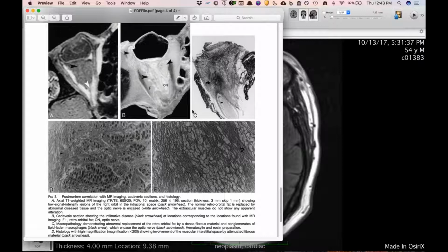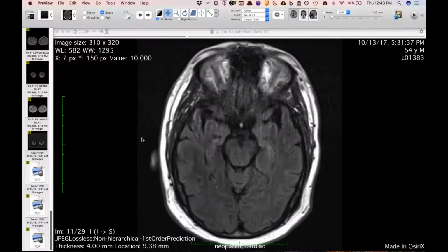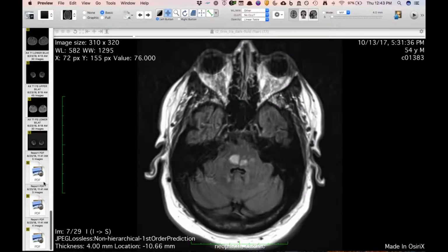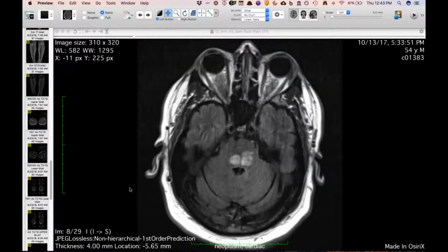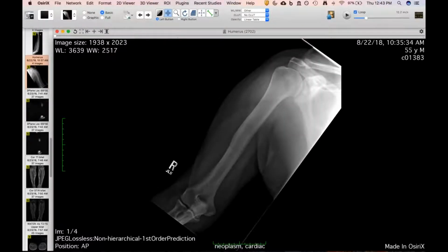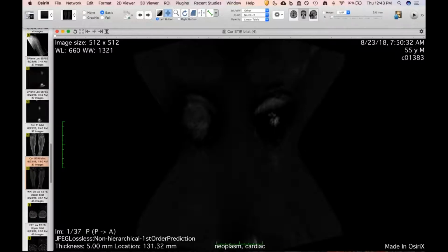Jeez. So, did your case, Seth, have orbital involvement or neuro involvement? Do you know? Oh, I don't look at that stuff. Sorry. I got to the superior edge of the kidneys. I say, okay, Erdheim-Chester. There we go. But I came prepared with all the bone stuff too, because I knew that was going to be David's first question. So, do the lungs have any pleural thickening?